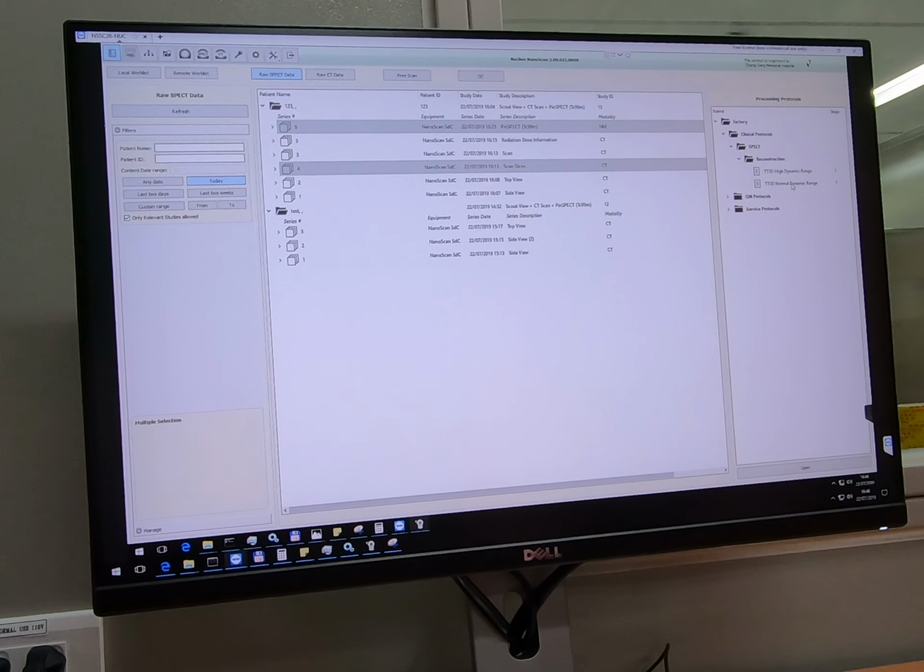You don't want to include the liver, you only need the lungs. This is when you should select the high dynamic range, because that kind of reconstruction algorithm can handle this situation. So there will be no distortion of the reconstructed image caused by the high accumulation in the really adjacent region in the animal.